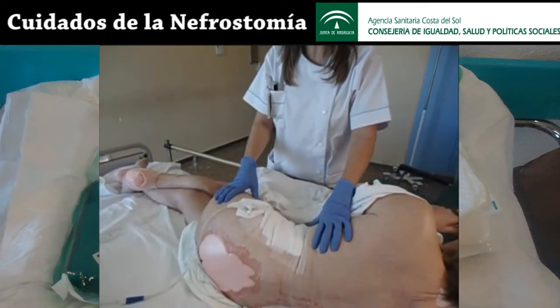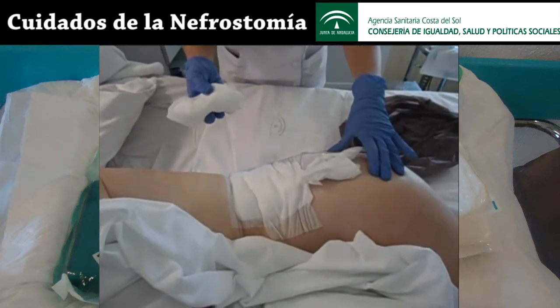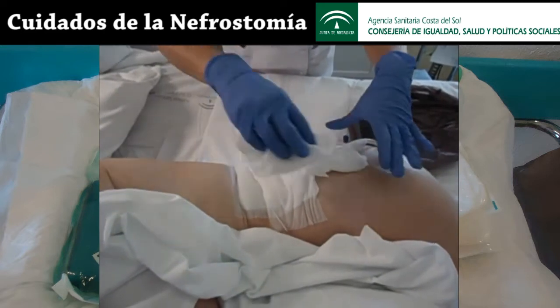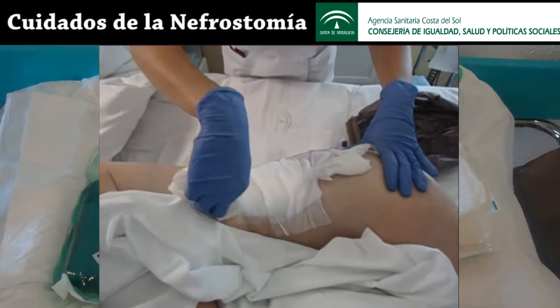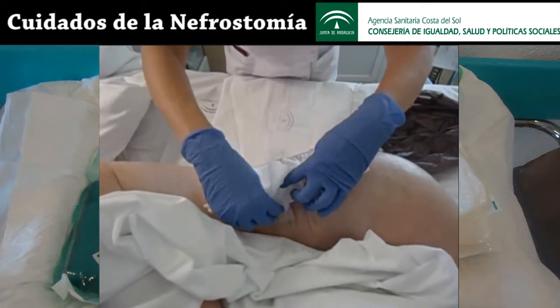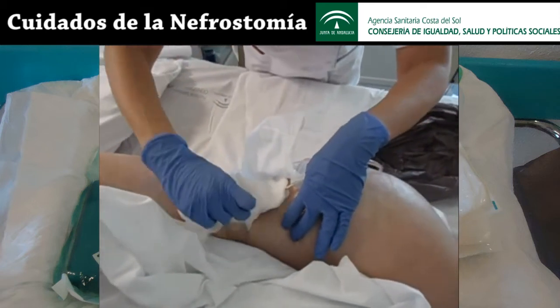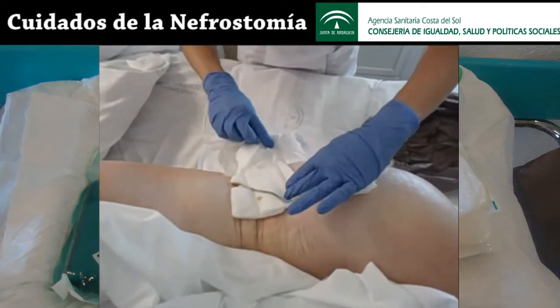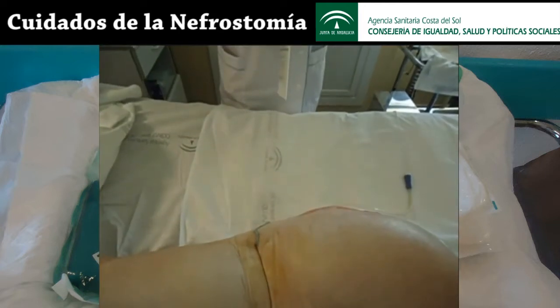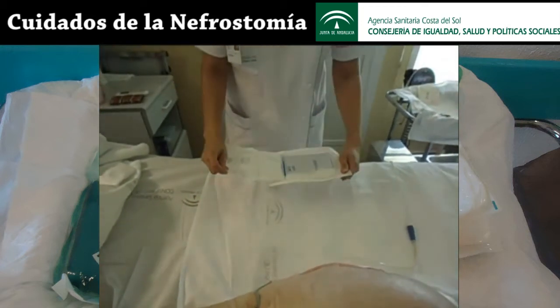Wash your hands thoroughly and put on new gloves to remove the old dressing. Wet new gauze pads with saline solution and gently remove the dressing. It is essential to proceed gently to avoid damaging the patient's skin and to keep the tube from being pulled out. Remove your dirty gloves and do hand hygiene immediately before preparing the sterile field.